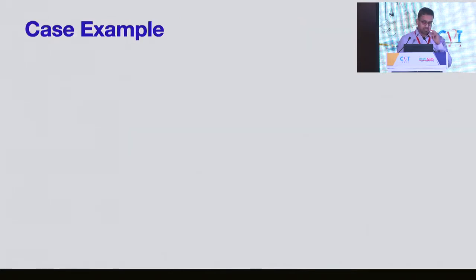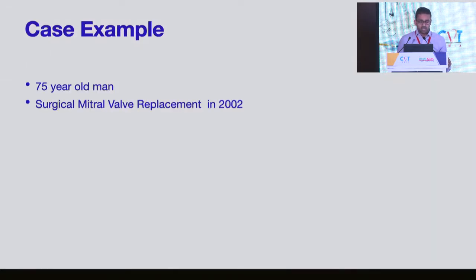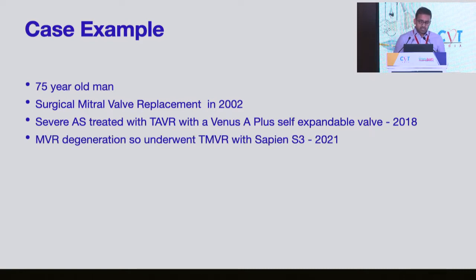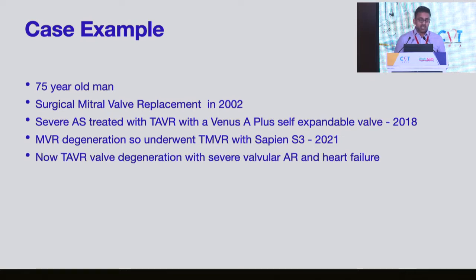Let me give you a case example. A 75-year-old man had a surgical mitral valve replacement in 2002. He had severe aortic stenosis, and he had a TAVR with a self-expanding Venus A Plus from China in 2018. He subsequently had degeneration of his mitral valve, so I did a TMVR with a valve-in-valve Sapien in 2021, and now his TAVR valve that was implanted in 2018 has degenerated. So here, recurrent transcatheter valve procedures, that's where we are now in India in 2022.